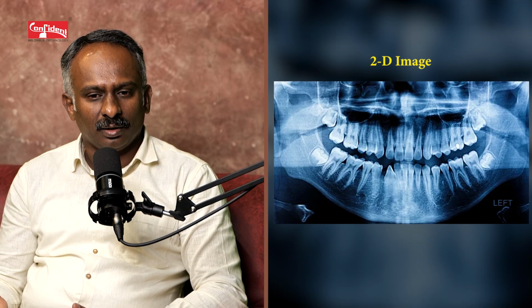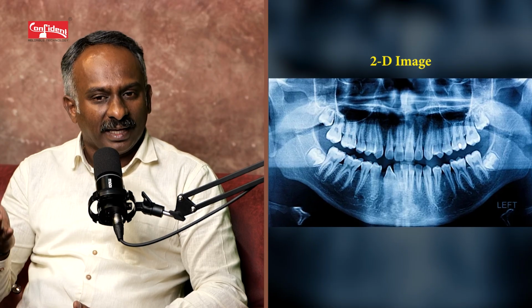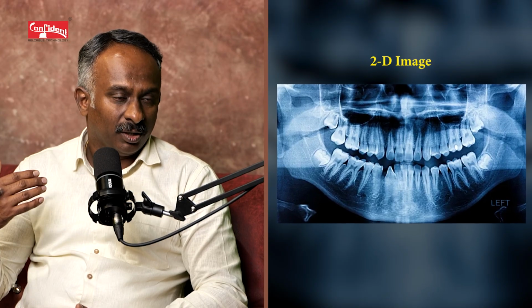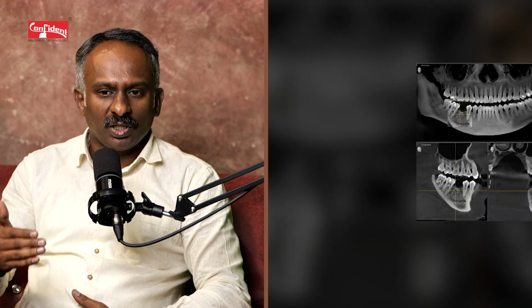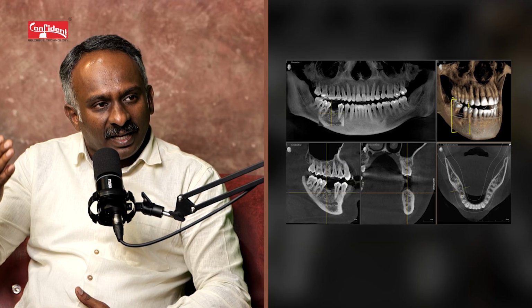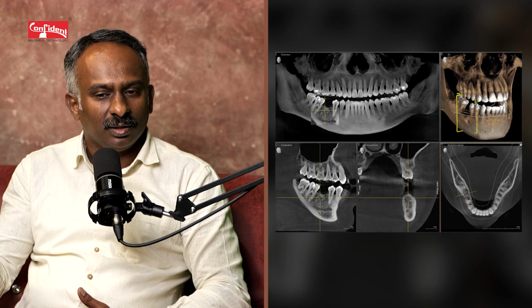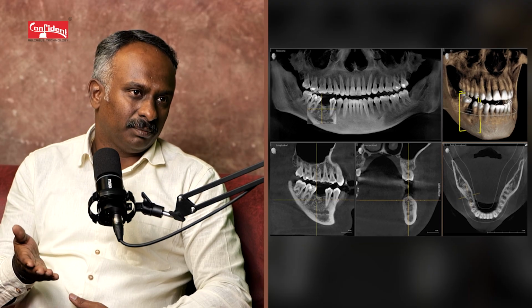But at the end of the day, the panoramic radiograph or the OPG is a two-dimensional image. So we have a lot of overlapping happening. Structures like your nose, your lips, or your spine all get overlapped onto a radiograph where we get one single image. In relation to that, a CBCT is a three-dimensional recreation of these two-dimensional things. So we have structures which can be layered like pages in a book. That is a major advantage of the CBCT in comparison to the panoramic radiograph or OPG.